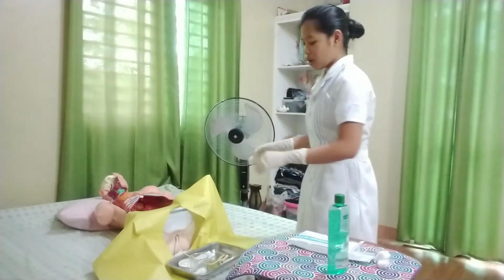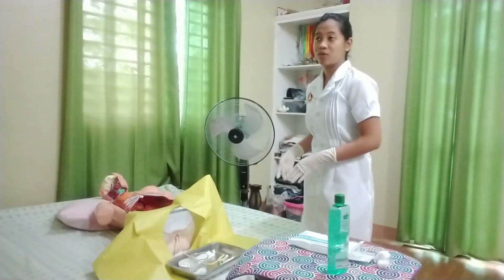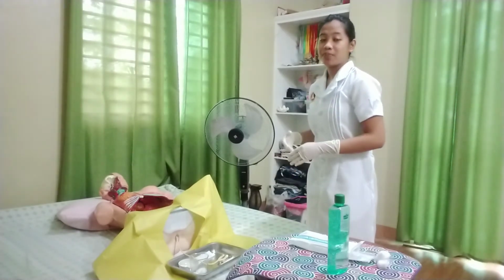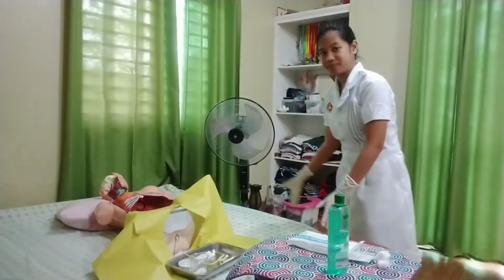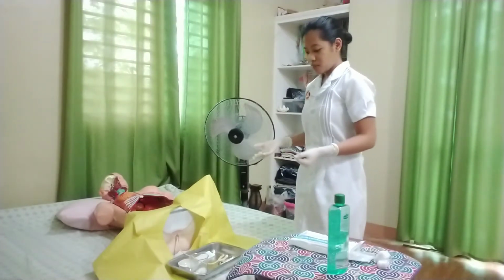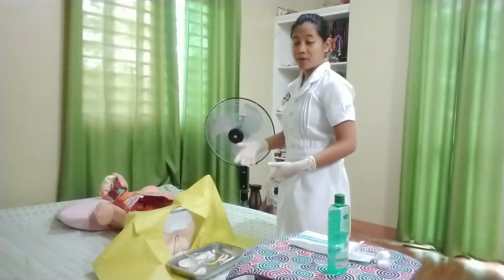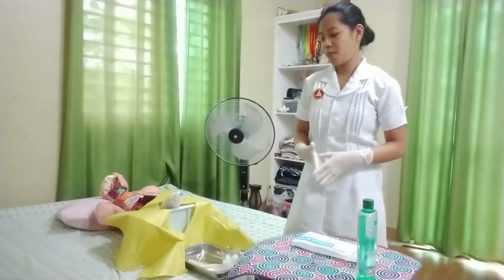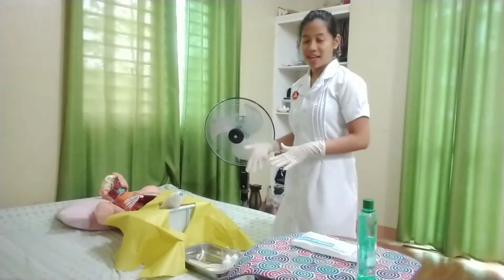After making sure that the catheter and the drainage bag are secured and will not be interfered with by any movements, we will hang the drainage bag below the bed. So assuming I already hung it up, we will keep our client comfortable, and after that we will clean all the equipment and keep the client dry and clean. So now that I'm already done with female catheterization, I will proceed to performing the male catheterization.